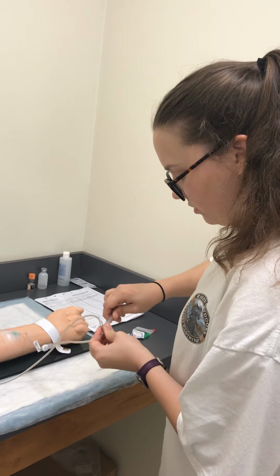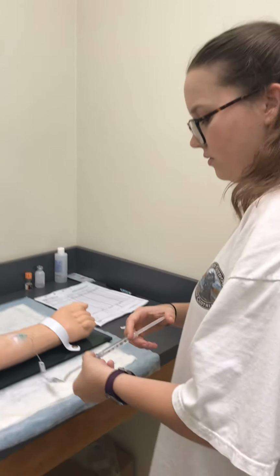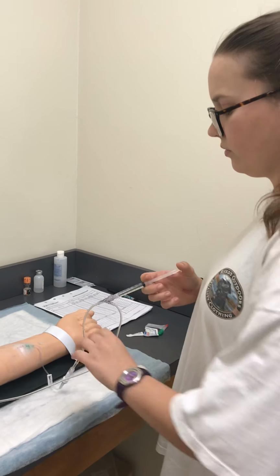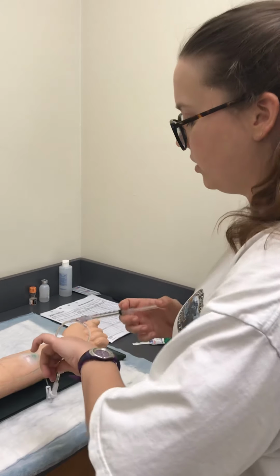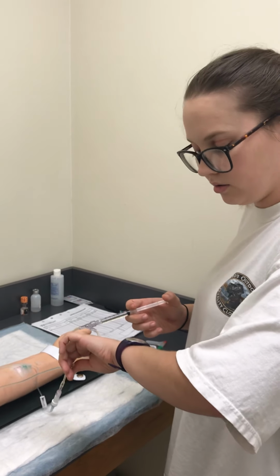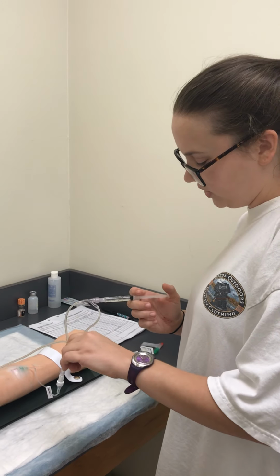Without touching the hub, keeping it sterile. I'm going to apply, kink the tubing, and we're going to administer 1 milliliter for every minute. So starting my time now, I've got it kinked.